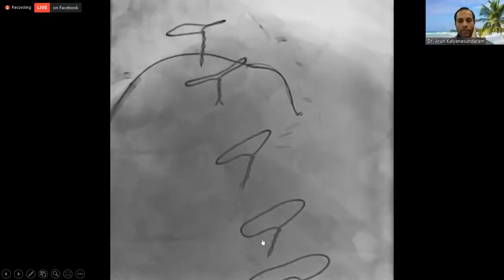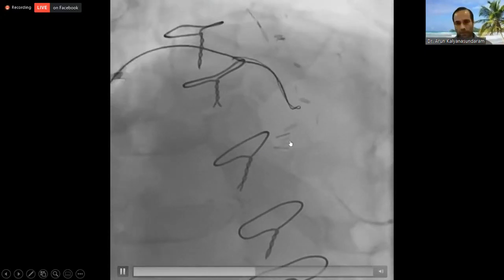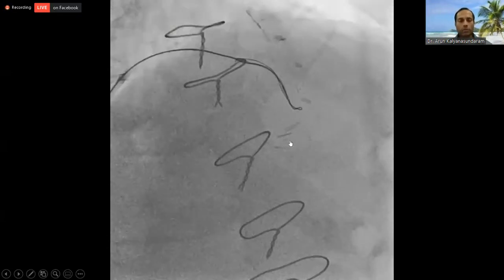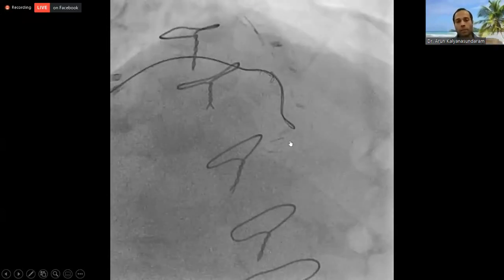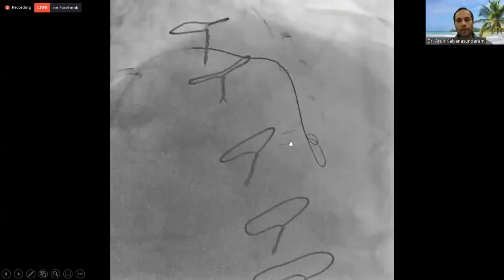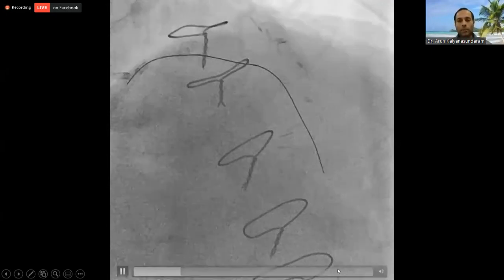It's in the architecture of the vessel. And how do I know that? I just injected retrograde and it's dancing with the vessel. So you are in the architecture. All right, so now more knuckle. I'm all set for using a Stingray. It really took a lot of force to get the knuckle going, as you can see. In fact, I finished it up with a Boston, but interestingly, we didn't have a Stingray balloon available.